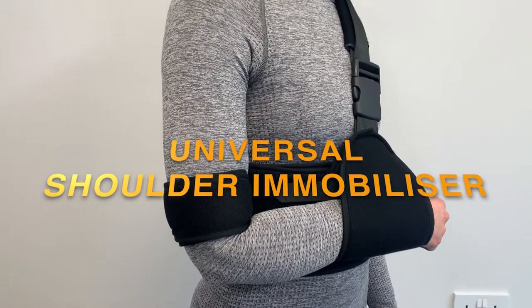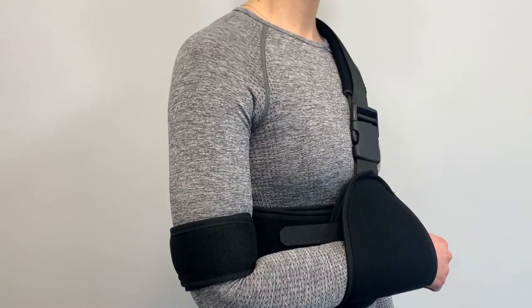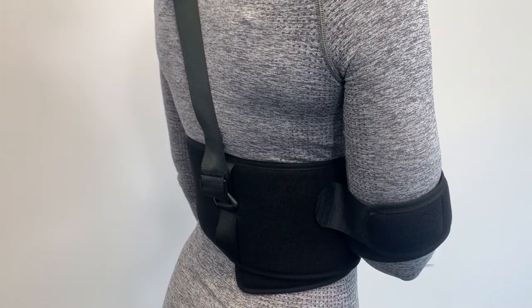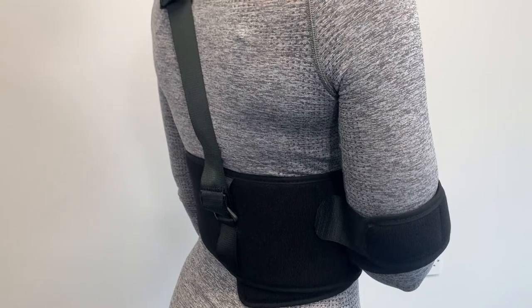The Universal Shoulder Immobiliser is designed for patients for post-trauma or post-operative treatment and can be fitted to the left or right arm. It completely immobilises the arm and shoulder to allow the joint to rest and heal.